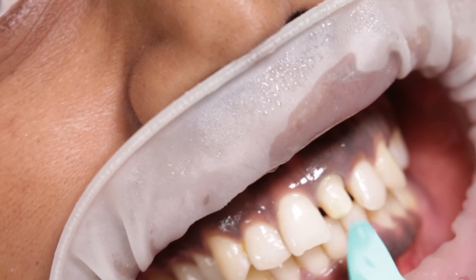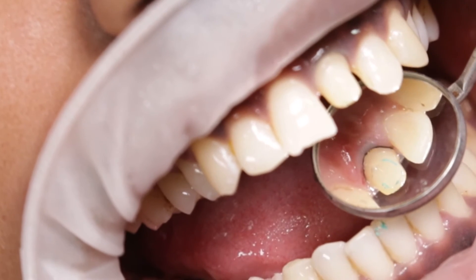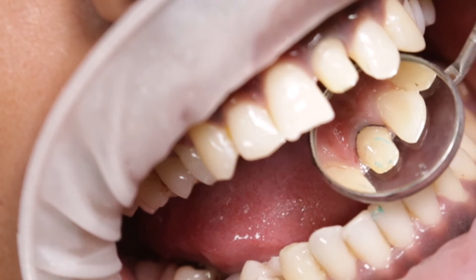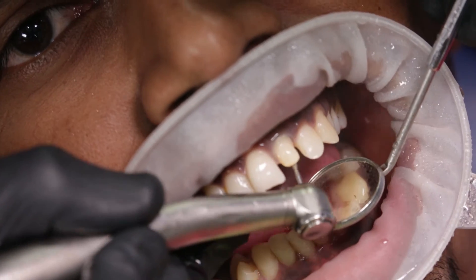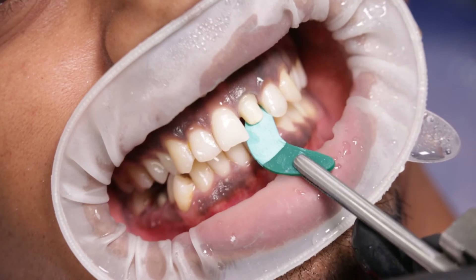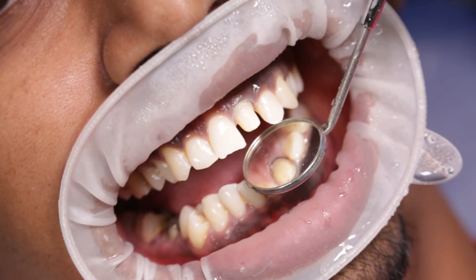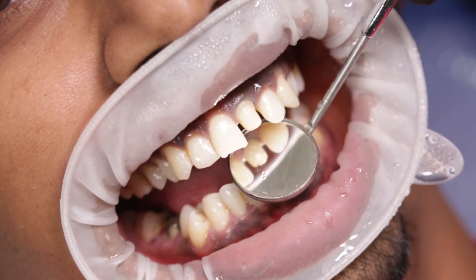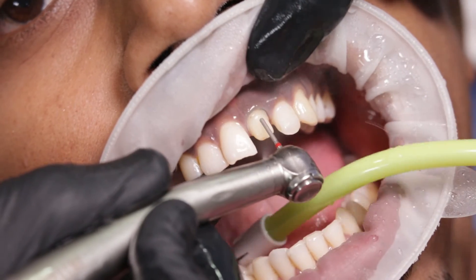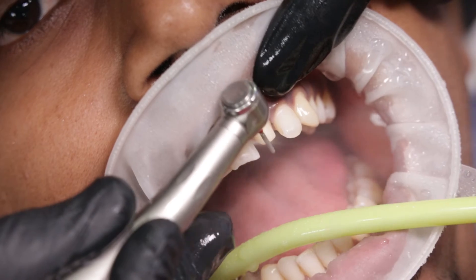To check the clearance I use a prep check strip which is exactly 1.5mm thick, and this gives me a reference of whether I have enough clearance or not. The colored spots on the tooth will be adjusted a little bit more till the strip leaves no marks at all. Once everything is done I take my red ring bur and round off all the sharp margins and remove any sharp points.